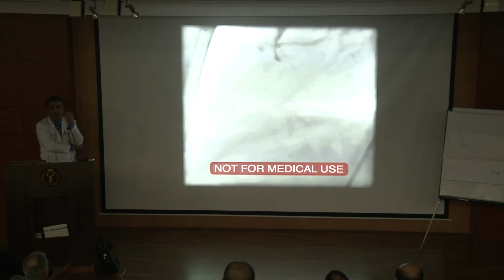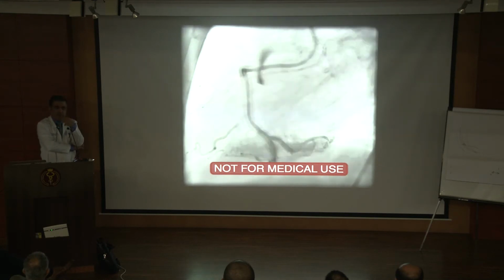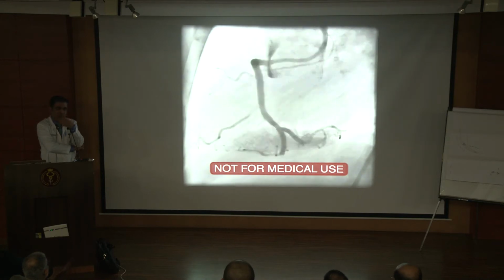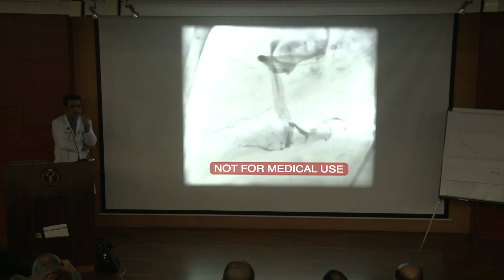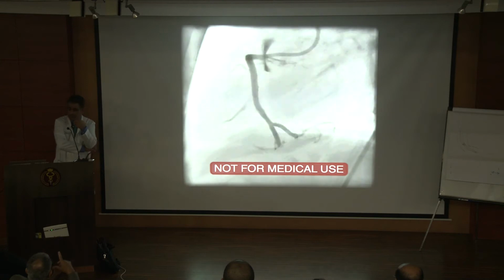Very commonly when you have a distal bifurcation, it will be solved by a retrograde approach. So this is how the planning happens when you do the case. Actually, a lot of the cases we did over the past 2 days had a distal bifurcation. You've seen quite a bit of them.